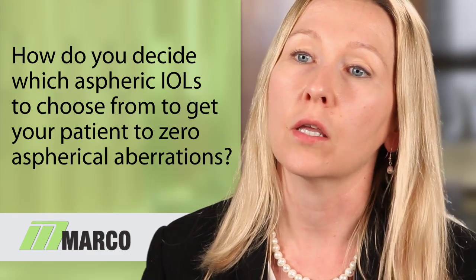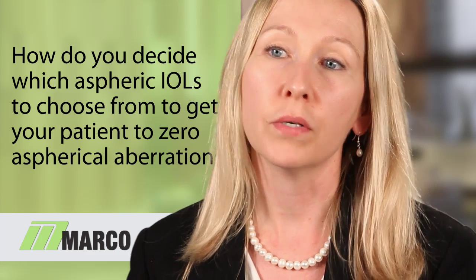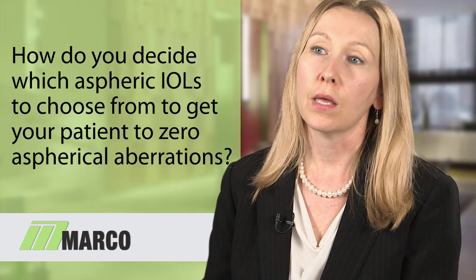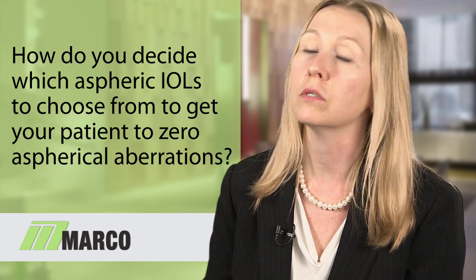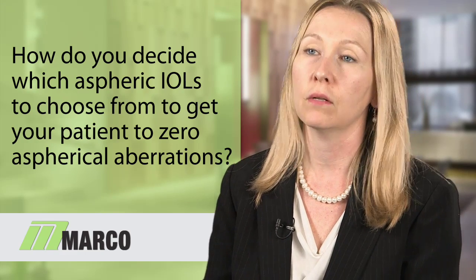An interesting case that I can share with you is that we had a patient recently who presented with a nicely implanted IOL with a best-corrected 20/20 vision, who was very unhappy. And she was not a premium IOL patient, but she was still very unhappy.